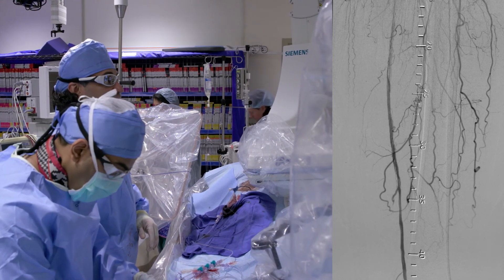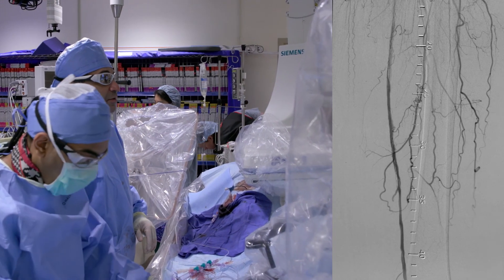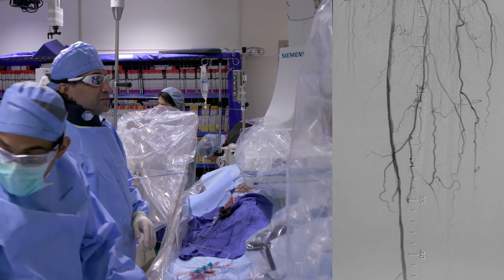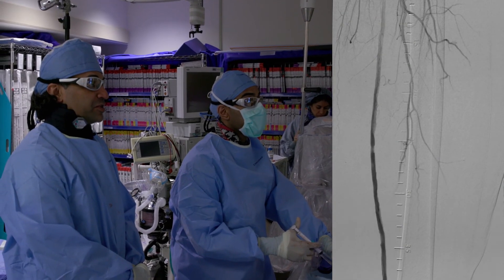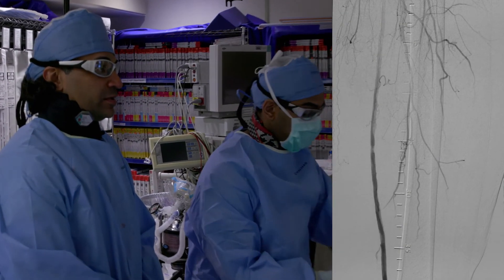That looks really good to me. We're going to go ahead and follow up with DCB. So that's post DCB.